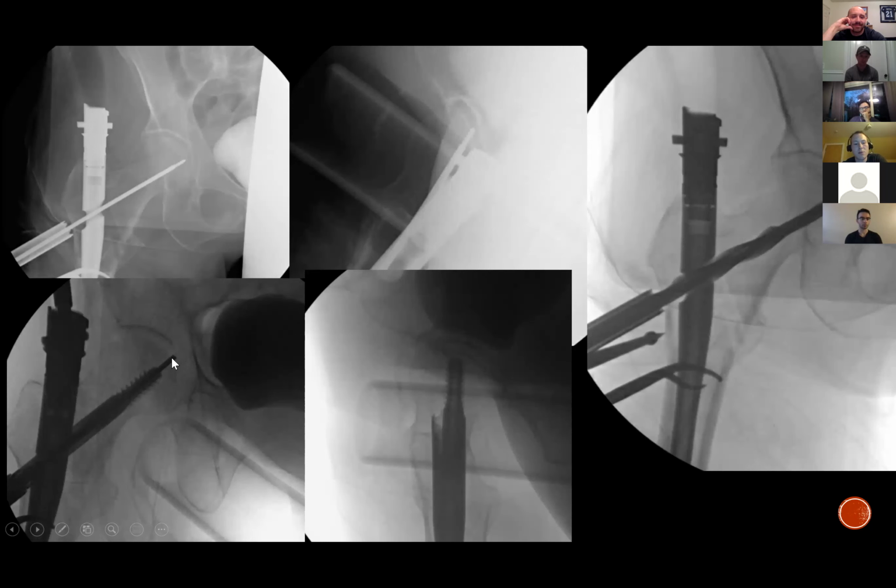The guide wire that they placed is now in the hip joint. But they did an interesting trick, and they knew when this case was done that they had accidentally put this too far. And so in order to prevent this sharp tip from injuring the inside of that hip joint, before they were done putting the screw in, they switched it out. You can see this wire is actually in backwards, and there's a blunt tip right there. So they knew they had gone through and they put a blunt tip in order to protect the inside of the hip joint as they advanced that screw in.